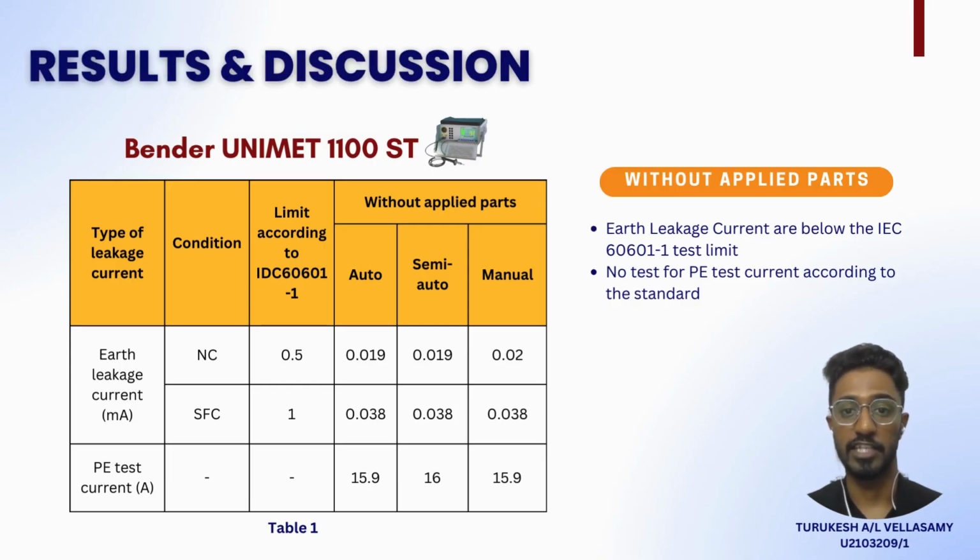Now let's take a look at the discussion. The electrical safety test is conducted on the assigned medical device, which is the bioimpedance Boca, using Bender, Rigel, and the self-designed measuring device in 4 different modes. Bioimpedance Boca is analyzed under normal condition and single fault condition.